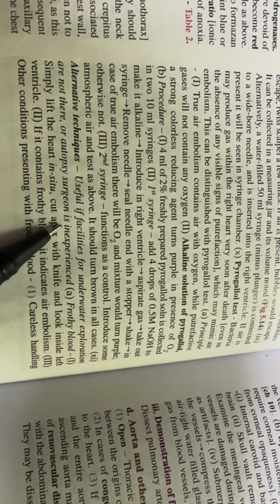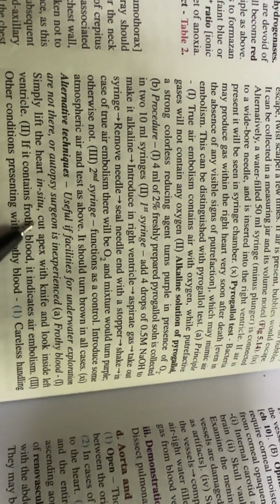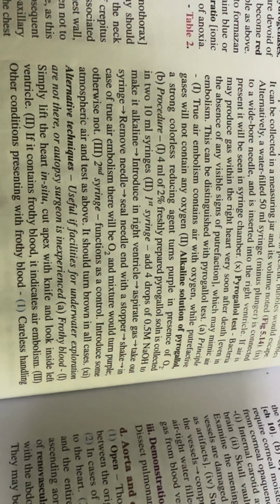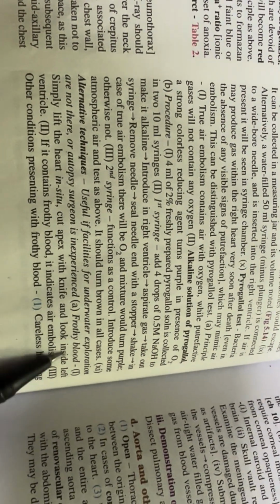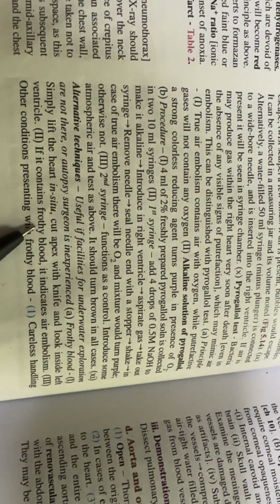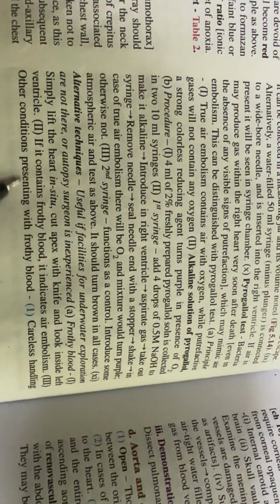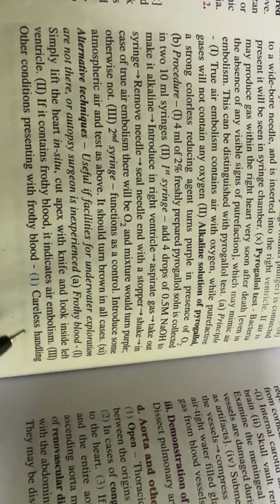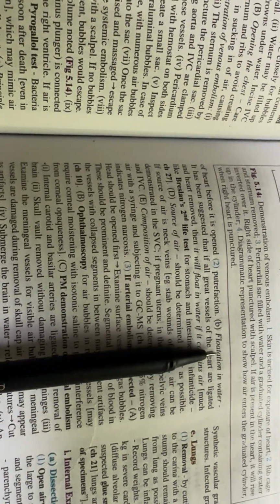Alternative technique, useful if facilities for underwater exploration are not there or the autopsy surgeon is inexperienced. Frothy blood: simply lift the heart in situ, cut the apex with a knife and look inside the left ventricle. If it contains frothy blood, it indicates air embolism. Other conditions presenting with frothy blood are careless handling of the heart before it is opened, and putrefaction.